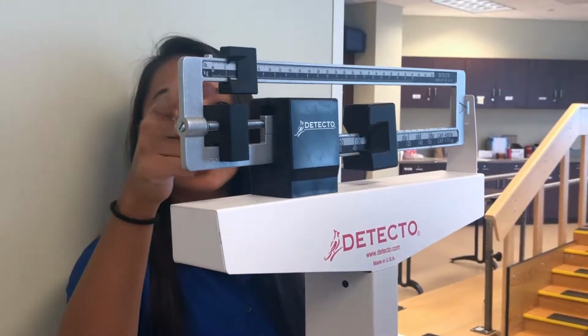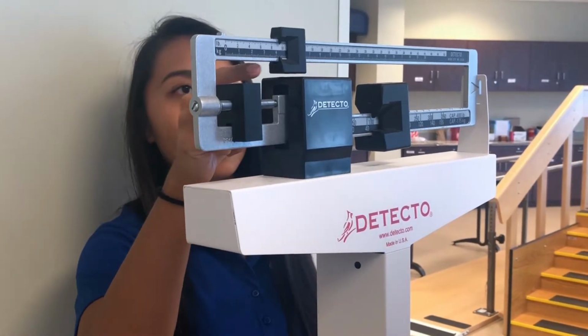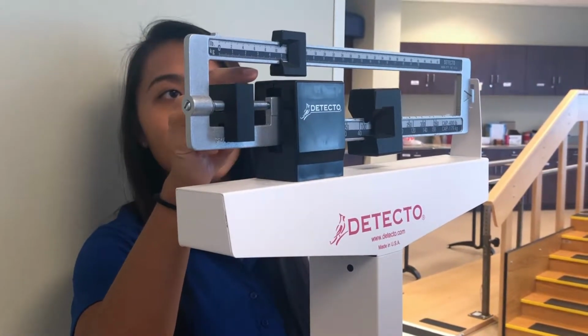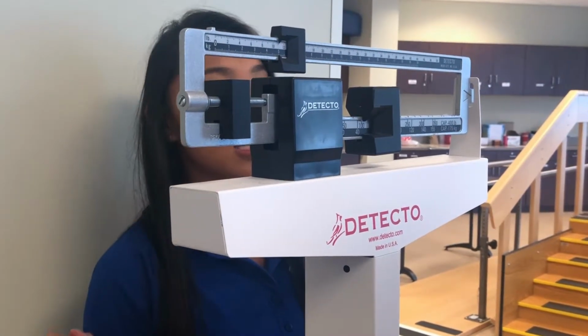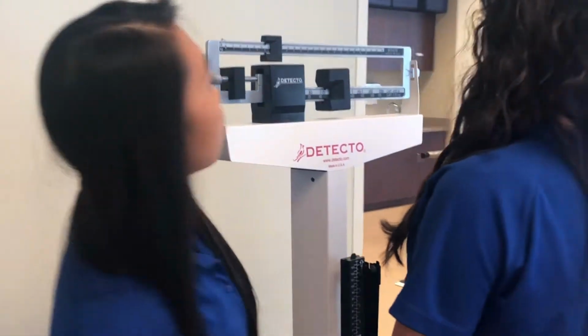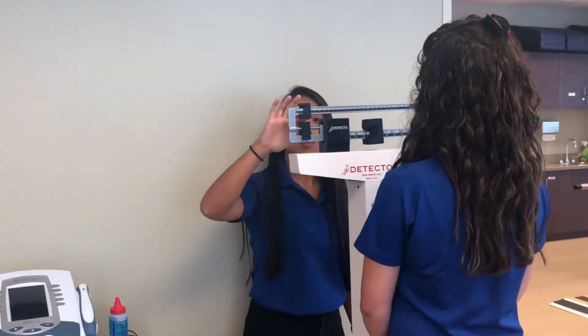And then again, slowly move the top weight and see if it stabilizes. Okay, and it's stabilized. And her weight is 111. So you want to make sure you move the weights back.